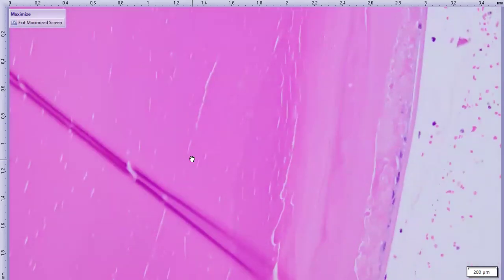And so these degenerative findings were present kind of circumferentially in the lens here. So mature cataract based on our section that we have here.